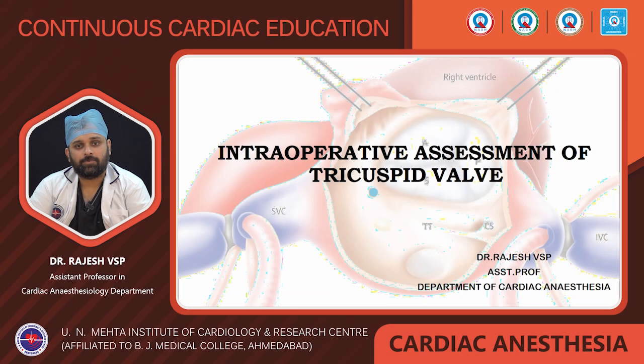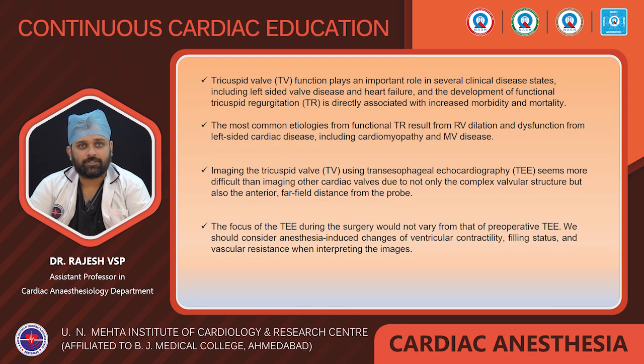Today's topic is intraoperative evaluation of the tricuspid valve. Coming to the introduction, tricuspid valve function plays an important role in several clinical states, including left heart diseases and heart failure, and also in the development of functional tricuspid regurgitation. These are all directly associated with increased morbidity and mortality.